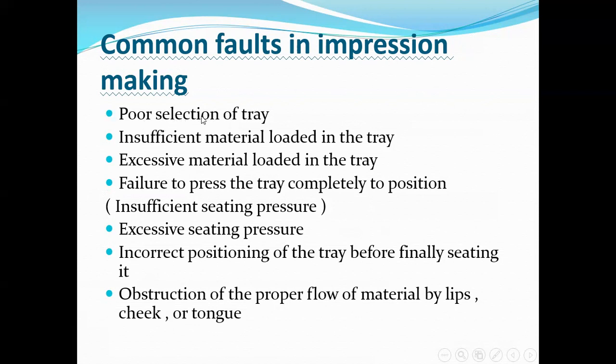Good selection of tray should be done: size of the tray, shape of the tray, type of the tray.